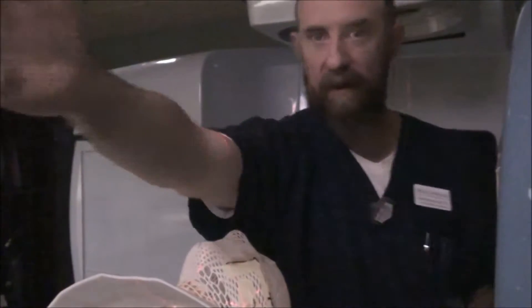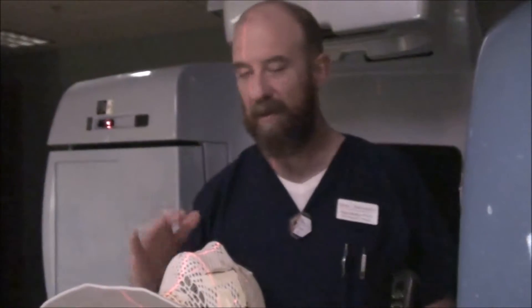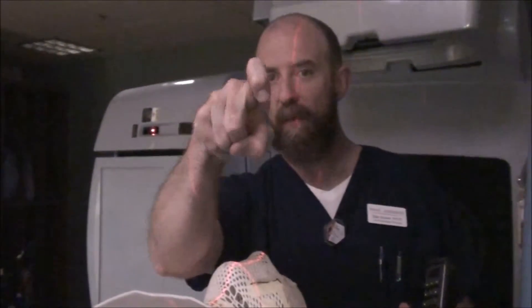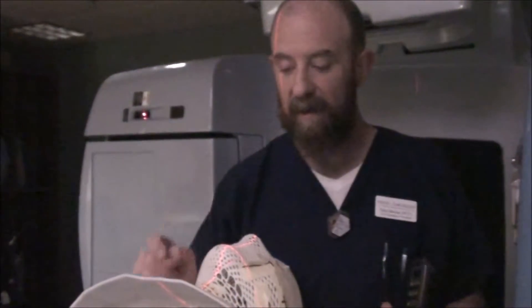You're going to adjust your table angle until that wire is superimposed upon itself so that it looks like one wire instead of a big U-shape. Once you've got that set, call in the doctor. Let the doctor look at it and see if any adjustments need to be made. The doctor may adjust the field size or adjust the patient up and down — that up-and-down is not going to matter if you've got that inferior table kick correct. Once the doctor says everything's cool, notate everything.